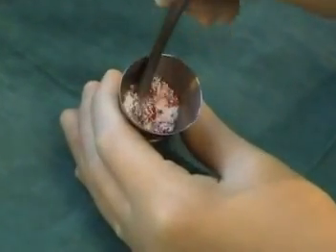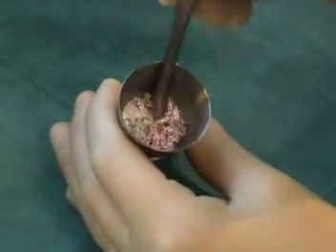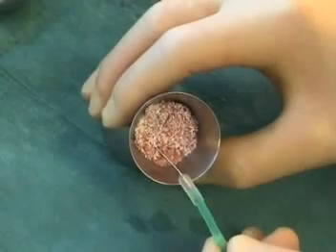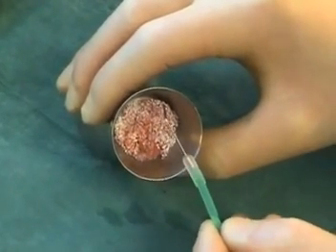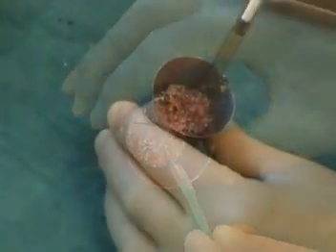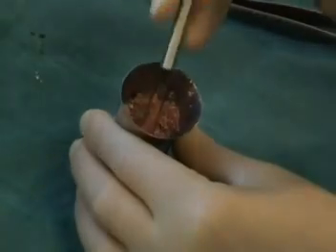The particulate is then thoroughly mixed with autogenous bone derived from the bone trap. This mixture is then slightly moistened with saline solution. The prepared graft is condensed into a dispensing syringe.